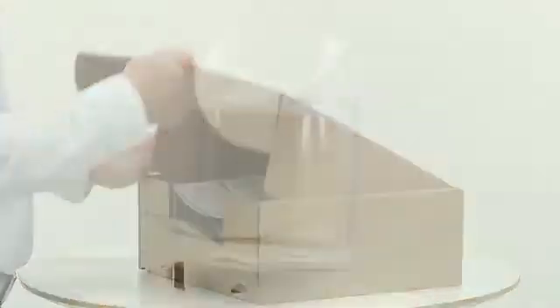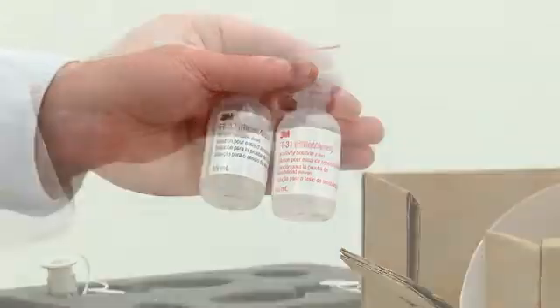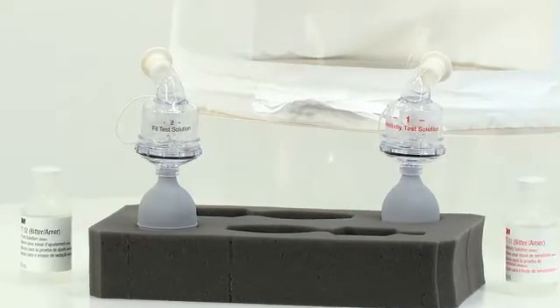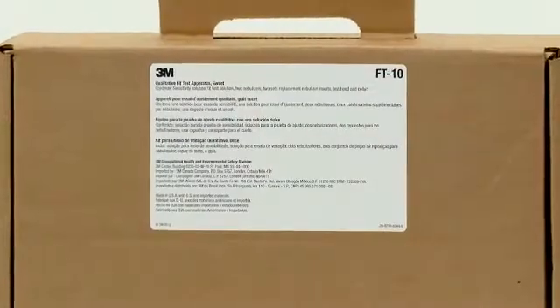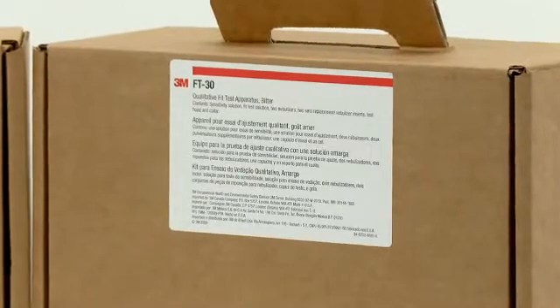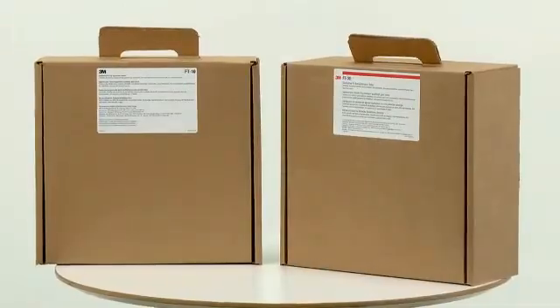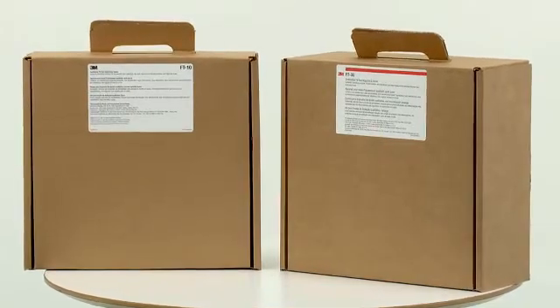The box contains a hood and collar, two nebulisers, two bottles of solution, spare nozzles, and user instructions. Replacement parts are available if any damage occurs or the solution runs out. Two versions of the test kit are available: the 3M FT10 uses a sweet tasting solution and the 3M FT30 uses a bitter solution. The two kits allow a choice to be made and provide an alternative if someone is unable to taste one of the test solutions.